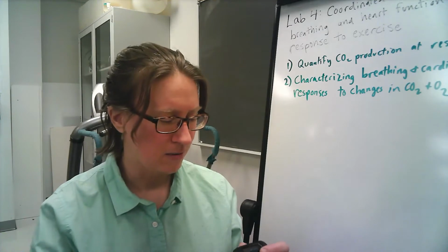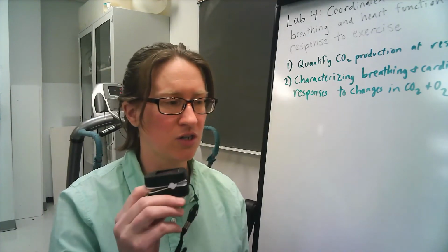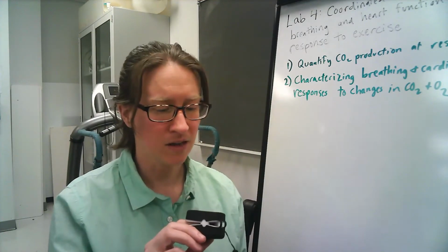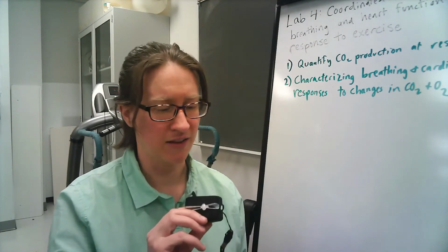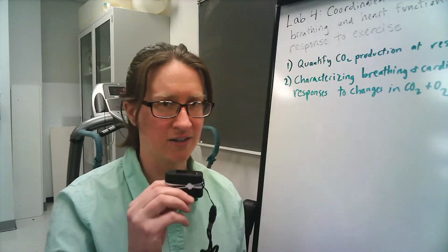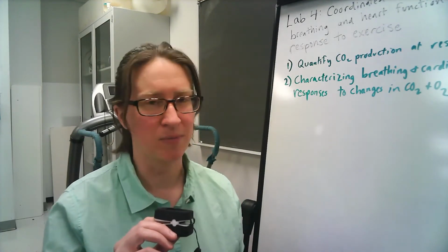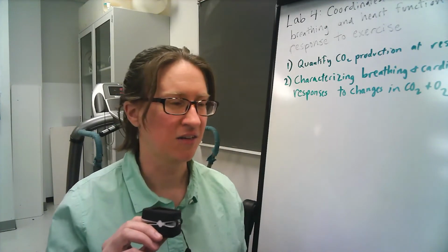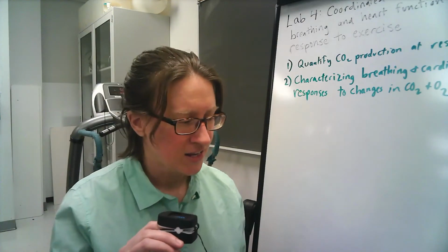But for this, basically what you'd want to do is record your heart rate, your pulse rate with one of these, and then this also provides an index of your blood oxygenation level. So right now this is giving me an oxygenation readout of 99%. So it's 99% saturation relative to fully oxygenated blood, the maximal oxygen it could carry.